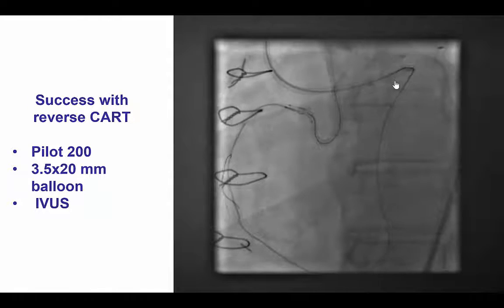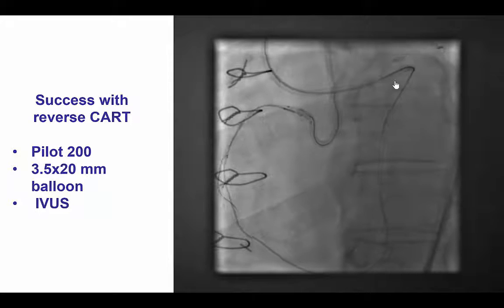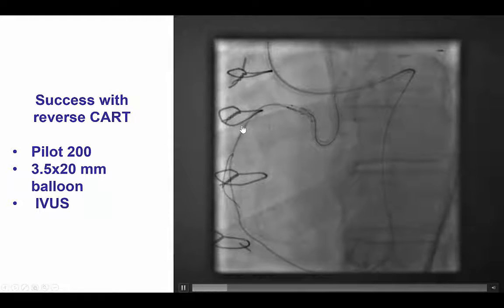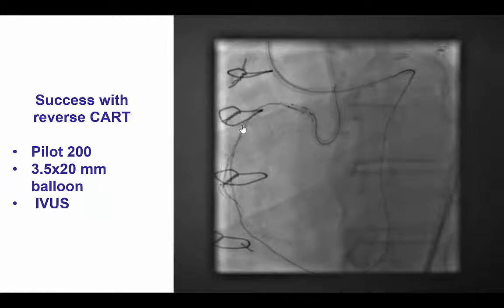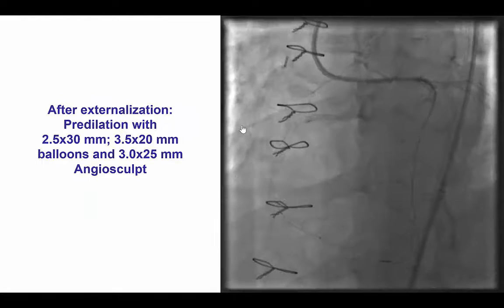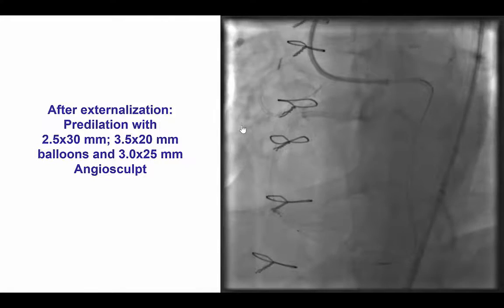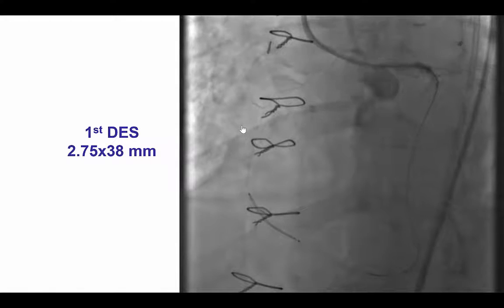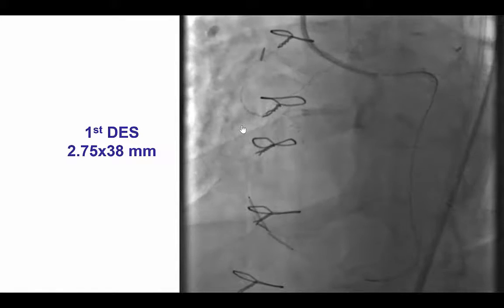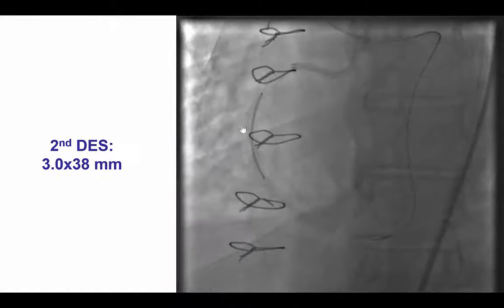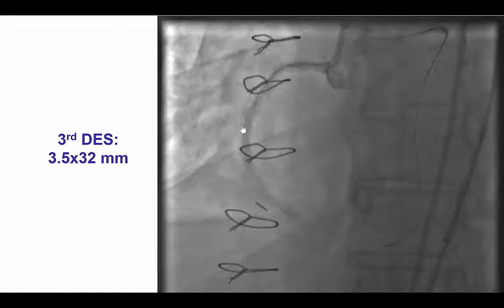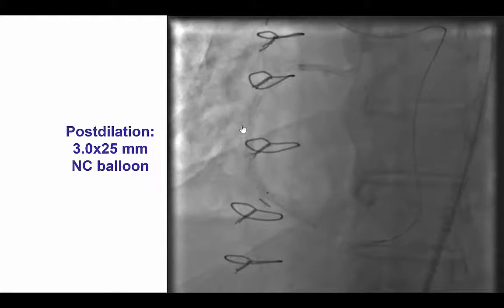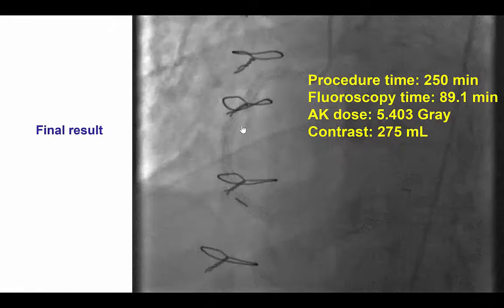Performing intravascular ultrasound was very reassuring that we indeed had crossing into the proximal true lumen. We then advanced the retrograde wire into the antegrade guide catheter, advanced the retrograde Corsair into the antegrade guide, switched for an externalization wire, and then performed pre-dilation with several 2.5 to 3.5 mm balloons.